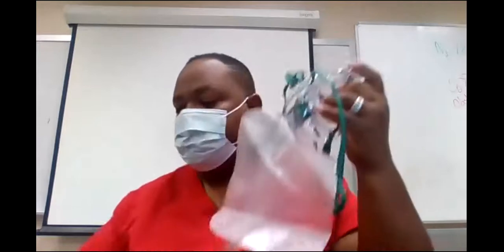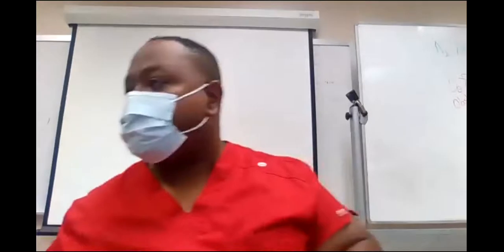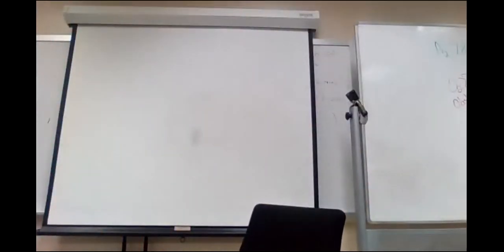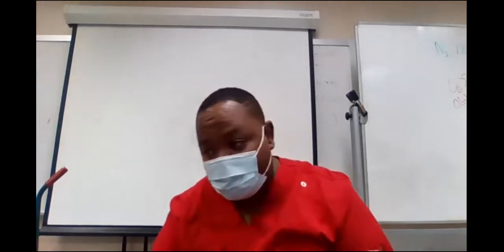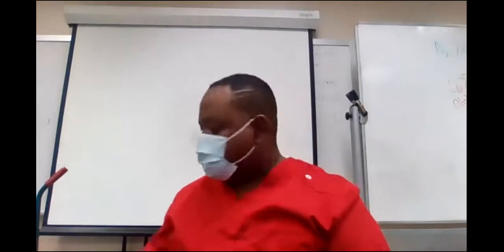Now, the liter flow for a non-rebreather or a partial rebreather is 8 to 10 liters per minute. What's the liter flow for the simple face mask? 5 to 8. And the nasal cannula is usually at 1 to 6 liters. We hardly ever go that high. We usually do 4 or 5 liters. If that ain't working, we go on to something else. Okay? So let's look at it in action.